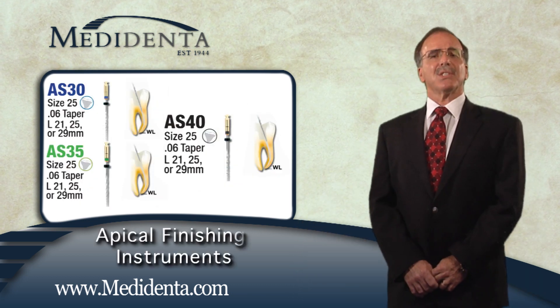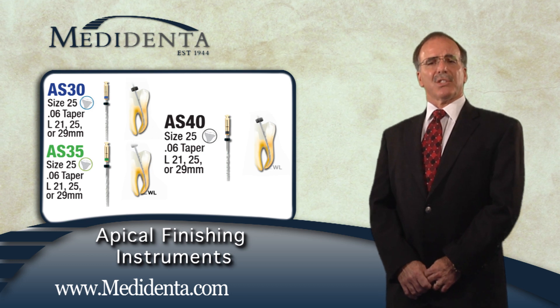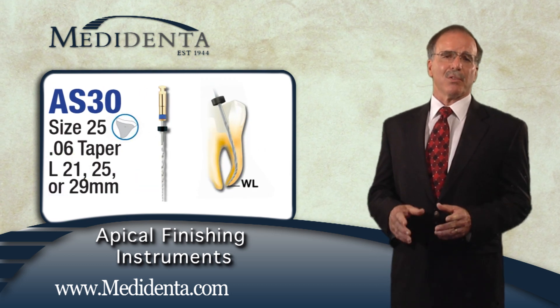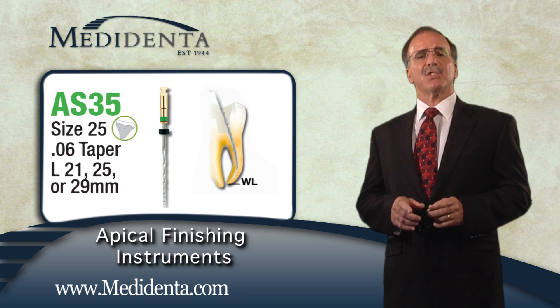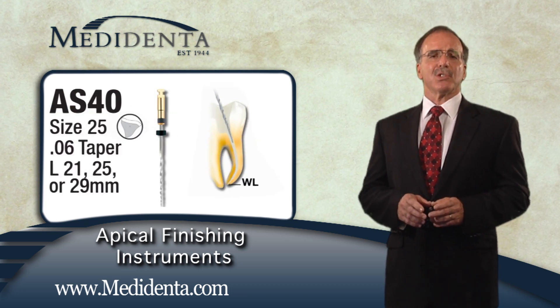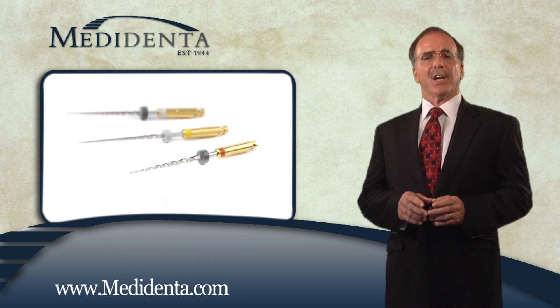In clinical cases, if the practitioner prefers to instrument the canal to a larger apical size, the REVO-S system offers apical finishing instruments: the AS30, AS35, and AS40. Each apical shaper instrument has an 06 taper and a specific tip size of 30, 35, or 40.